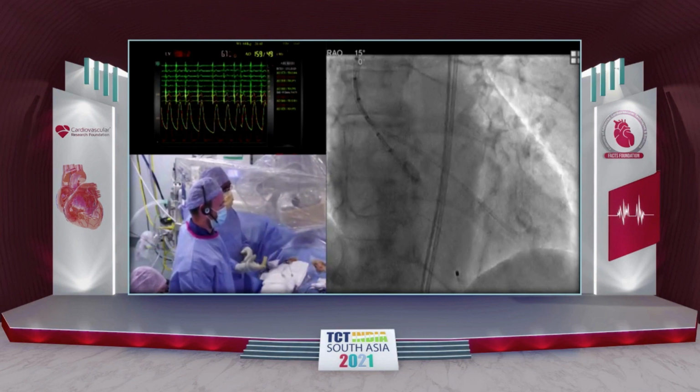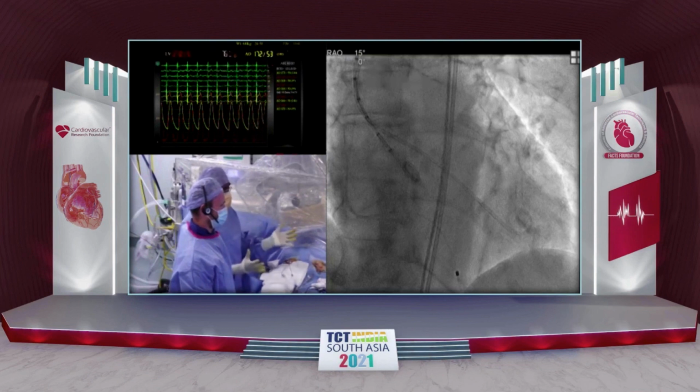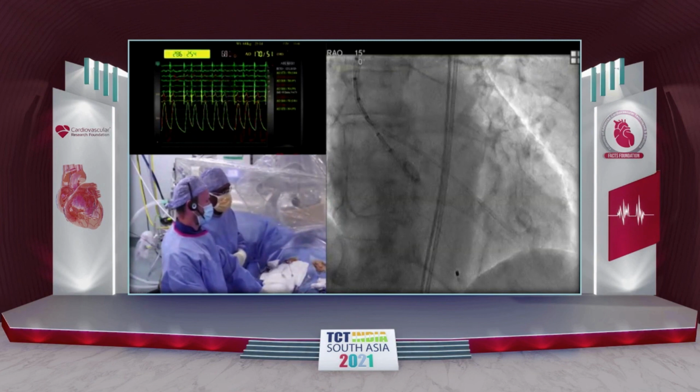But also remember, this technology has an external skirt, which is a unique type of skirt. Nobody's done it this way, and it does fill the space. We were part of the Portico NG study, which is the Navitor valve. We did 18 patients here. Of the 18 patients, we had only one pacemaker, and two patients had mild PVL, and the rest were all trivial or none. So the concept seems to work actually quite well in this patient group. But okay, we'll see.